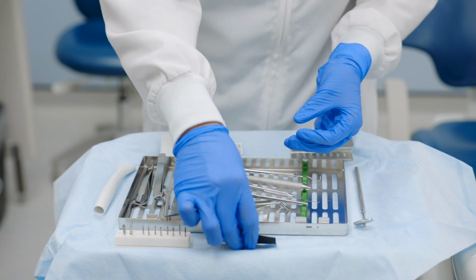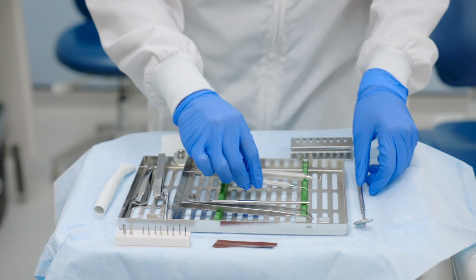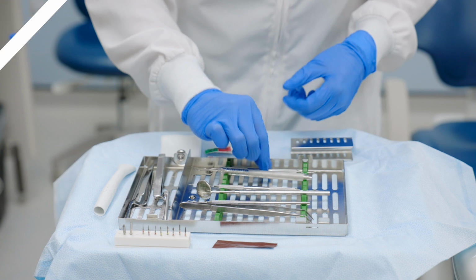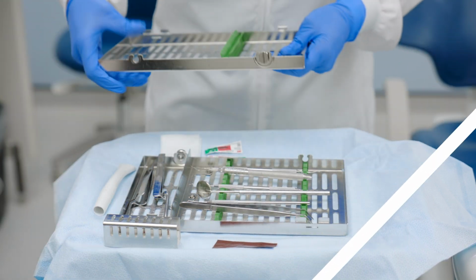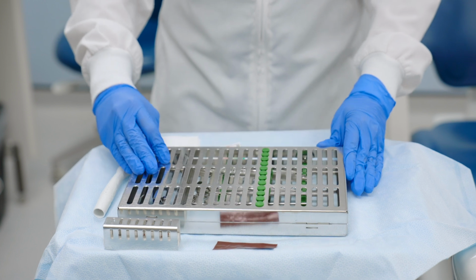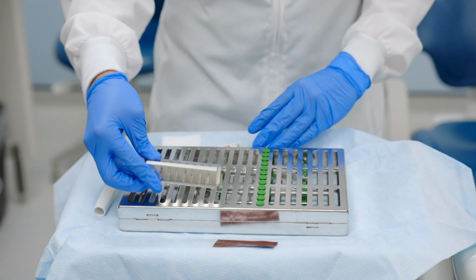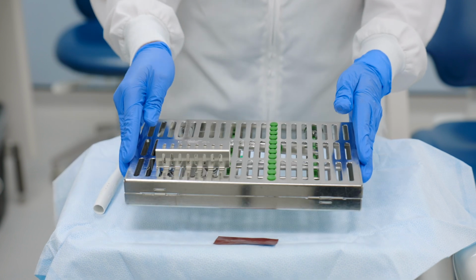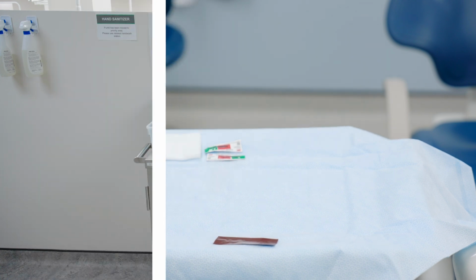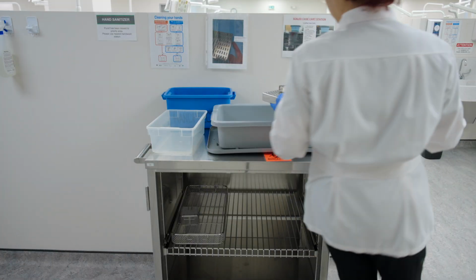Remove the chemical integrator, cotton or gauze, and any other consumable items in the tray and place on the blue sterilization wrap. Place the lid back on the tray and secure by turning the knobs to the closed position. Ensure there are no sharps sticking out of the tray by checking all borders. If necessary, open the tray and reposition the instruments and close securely. Take the tray and any other reusable items to be reprocessed to the soiled instrument cart.